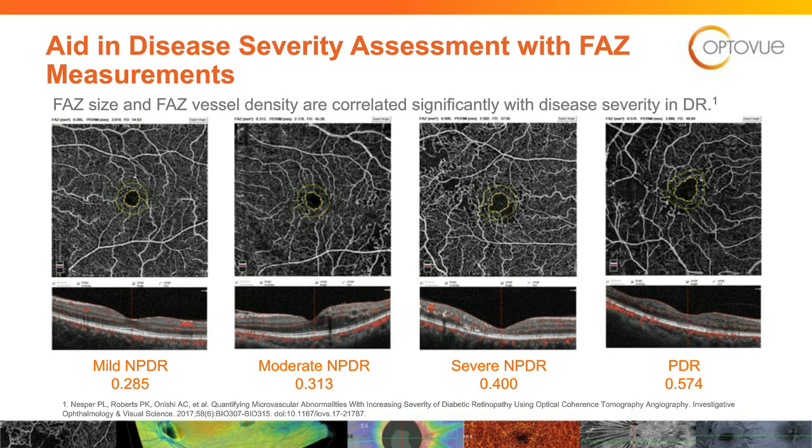I've seen a few diabetics that were very, very well controlled. They're very mild diabetics, not retinopathy, but very well controlled. Haven't had it that long. I had one today where I had an FAZ area of 0.15, right in the middle of the normal range, but he was a diabetic, well controlled, really just controlled it with diet. And so he's got a better prognosis because of that FAZ being very, very normal. I'm feeling better about the development of his diabetic retinopathy, maybe slim, or it may progress much more slowly.